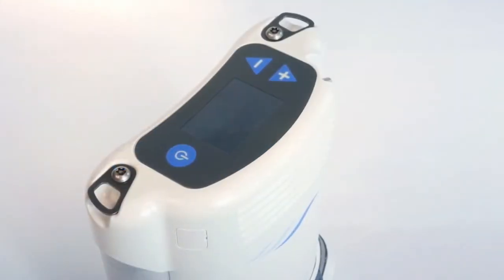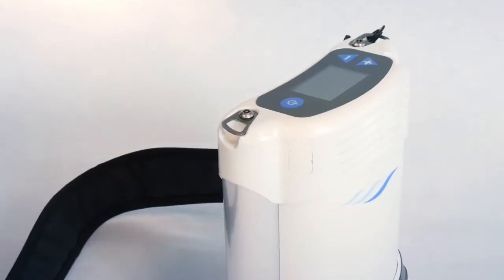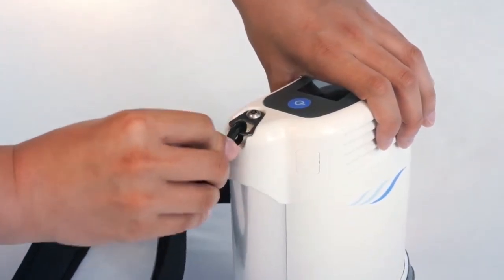To wear your Freestyle Comfort without its carrying bag, locate the metal tabs on the top of the device on either side and attach a shoulder strap clip to each tab.